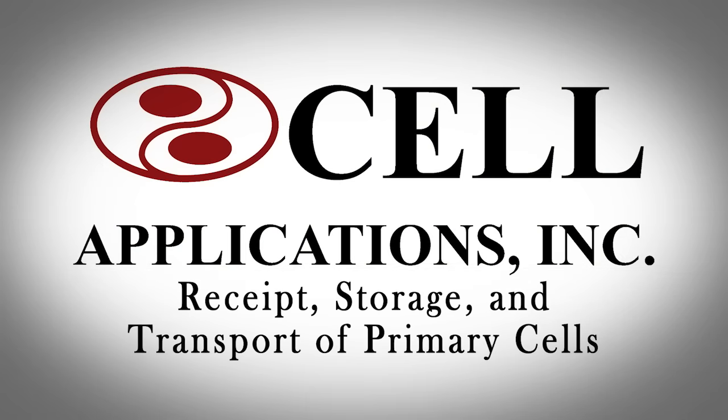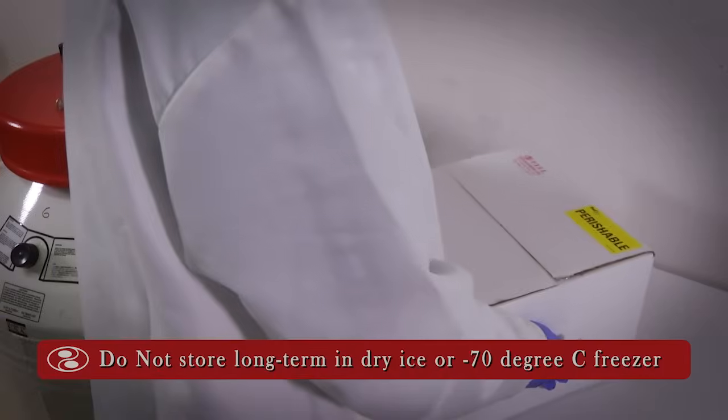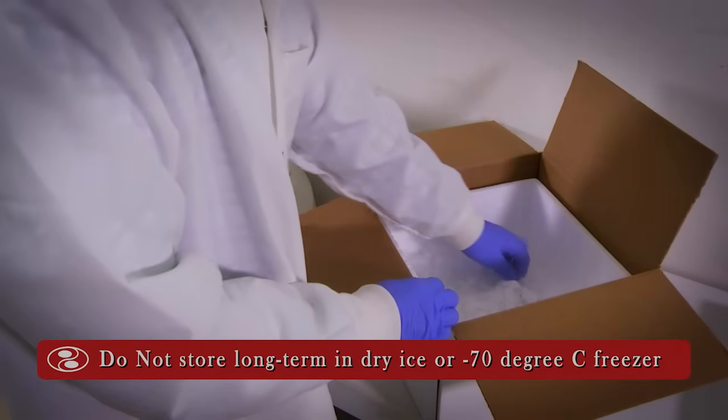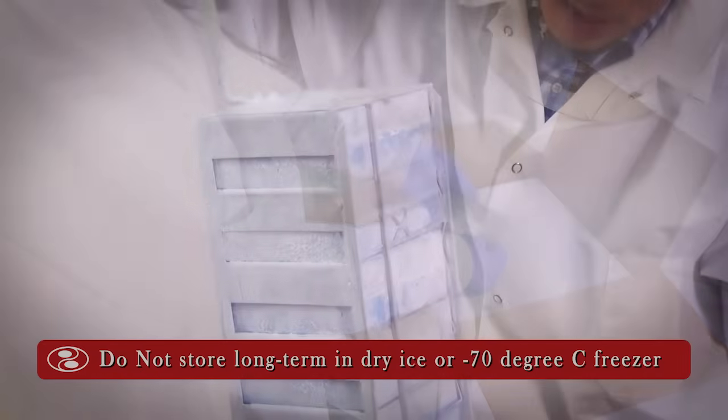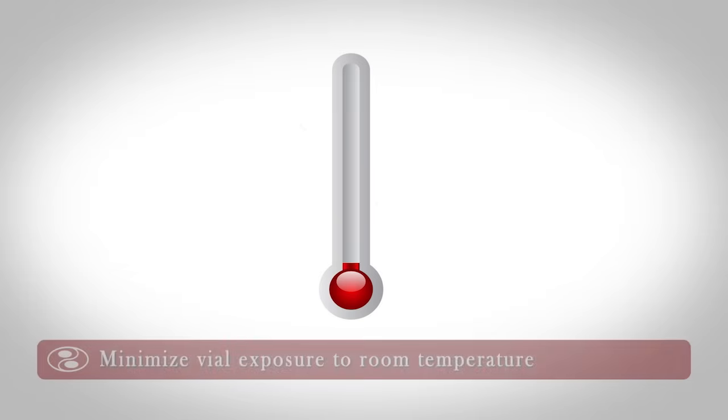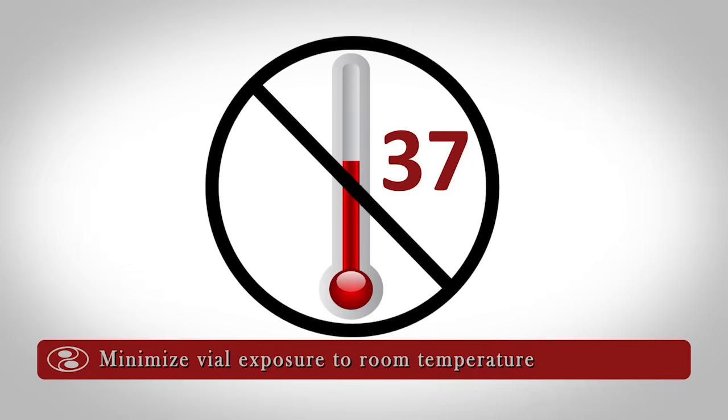Receipt, Storage and Transport of Primary Cells. Upon arrival, immediately remove the cryovials from their dry ice packaging and transfer them to a liquid nitrogen storage tank. During transport, always keep the cryovials submerged in dry ice. Do not at any point expose the cryovials to ambient temperature, as this could damage cryopreserved cells and compromise their performance.